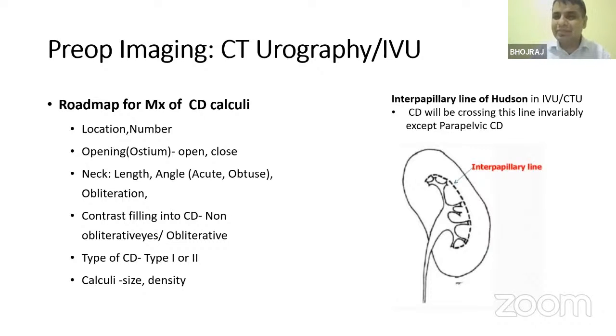But keep in mind that many of the times, once we go into the pelvicalyceal system with RIRS for diagnostic purpose and navigate there, you may be surprised that the stone is not visible. Such situations do come, and preoperatively you may not be thinking about whether the stone is within the diverticulum or not. A few subtle preoperative radiological findings can guide us about that.